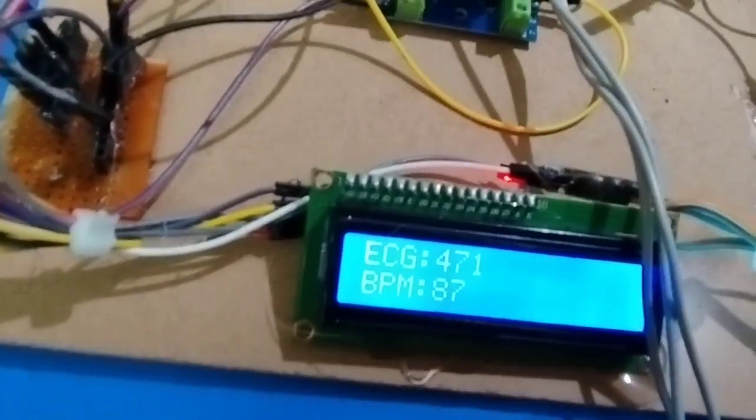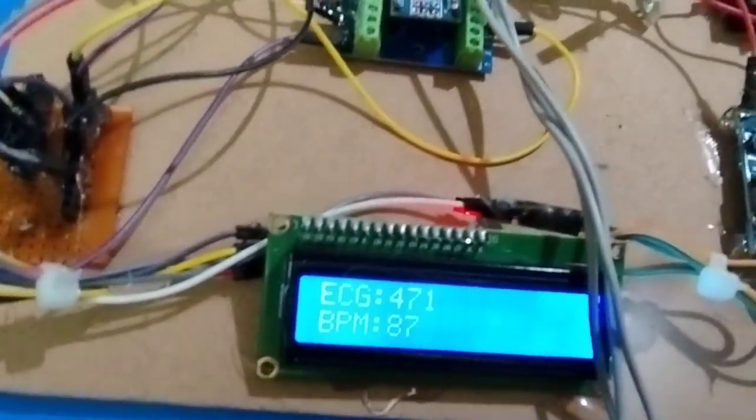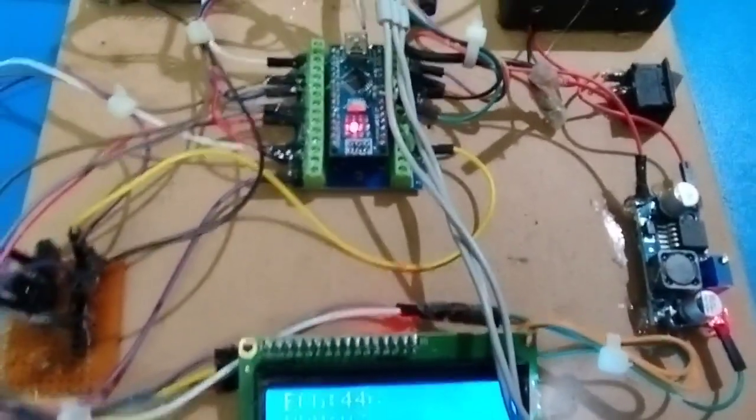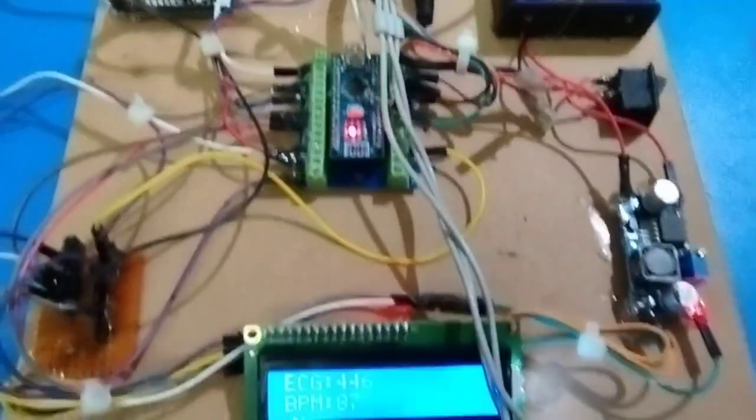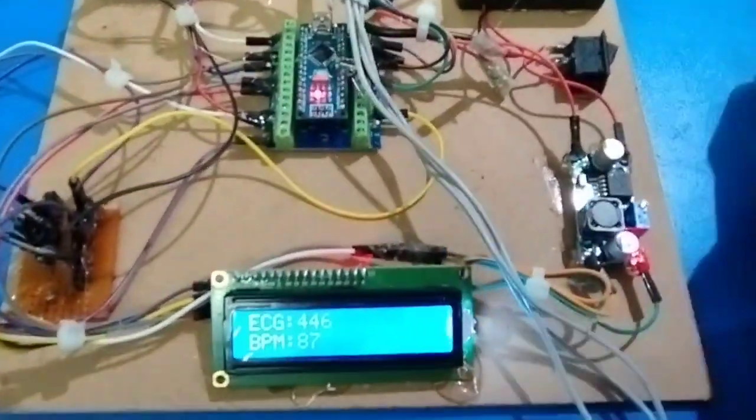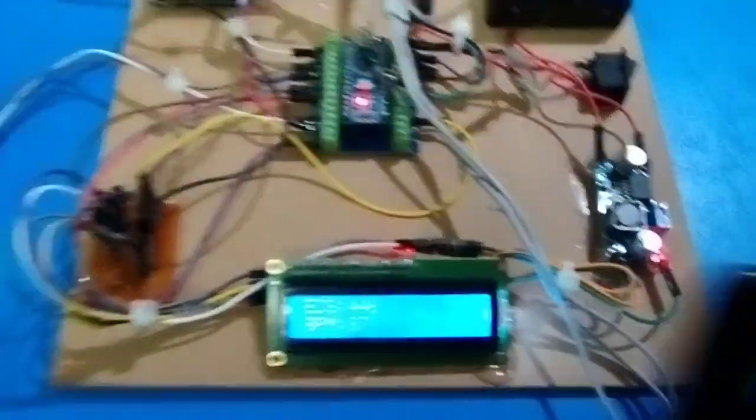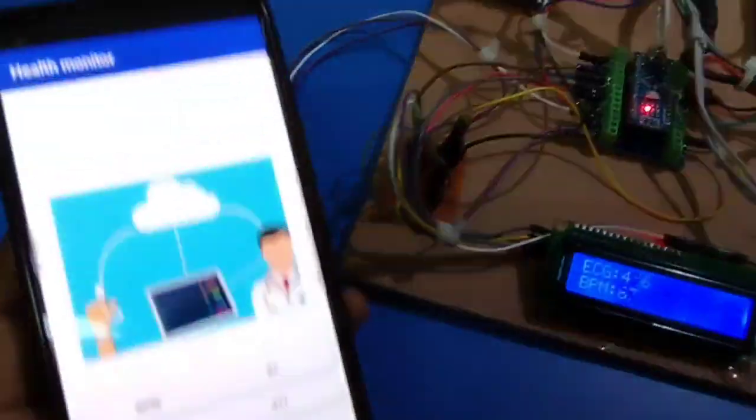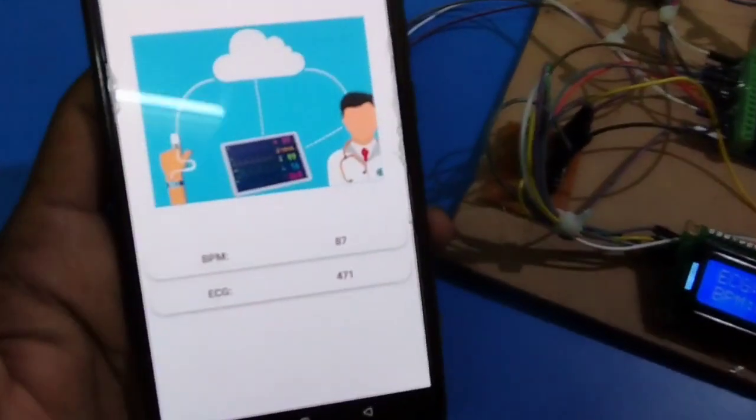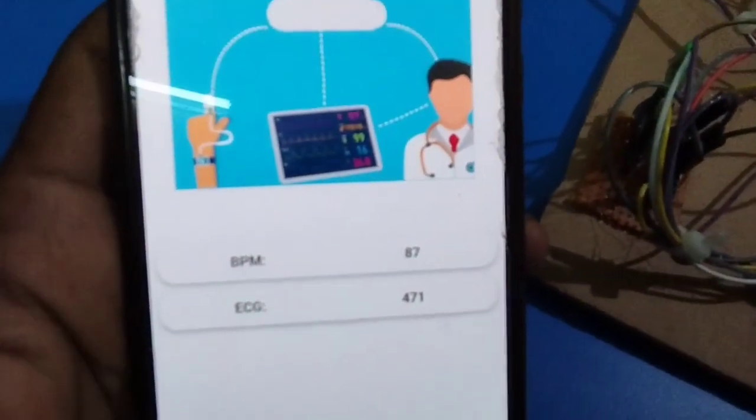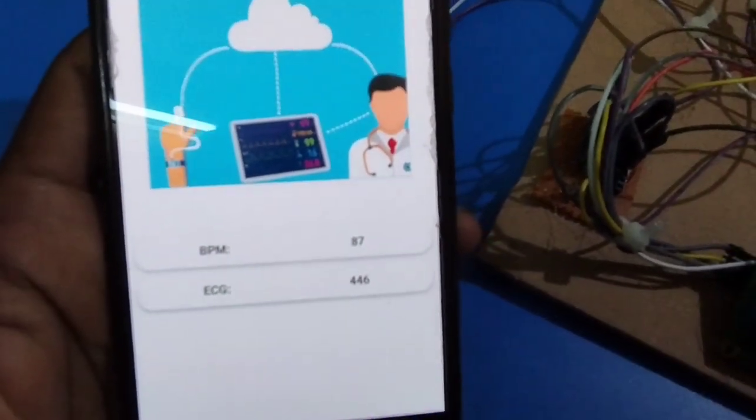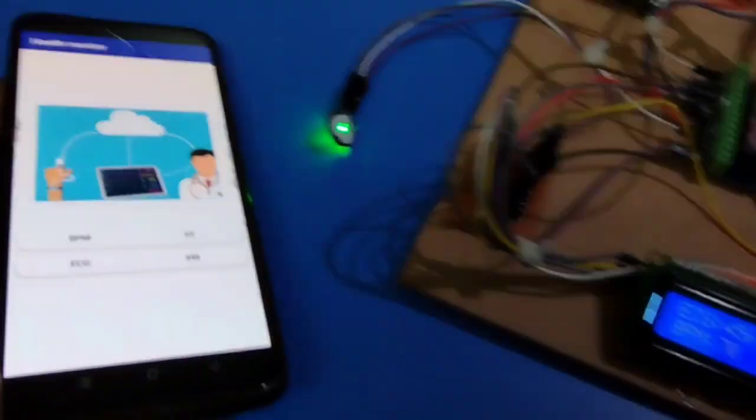This ECG data we are sending to Firebase. You will get the BPM data and ECG data with frequent updates in the application.